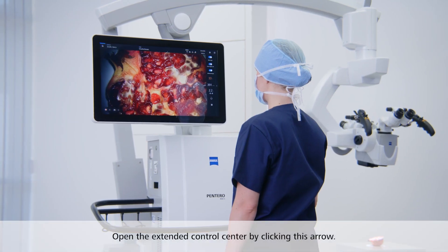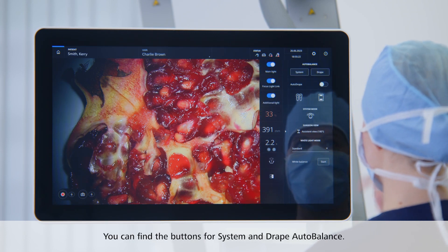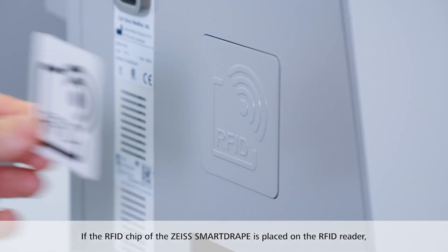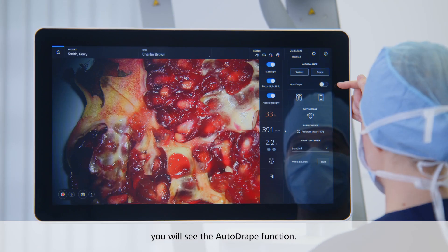If you want to access further settings, open the extended control center by clicking this arrow. You can find the buttons for system and drape auto balance on top. If the RFID chip of the Zeiss SmartDrape is placed on the RFID reader, you will also see the auto drape function here.